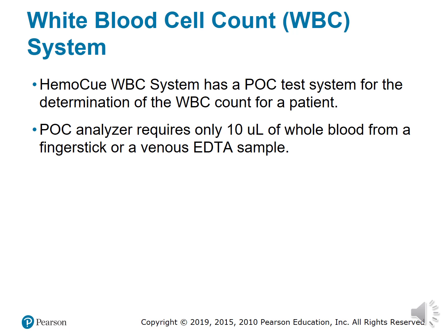Another point of care testing instrument that is now being used is your WBC system. This one also happens to be a HemoCue, but this one is called a HemoCue WBC system, which tests to check your white blood cell count. Because remember, if your white blood cell count is elevated, that means it's fighting some type of infection. Or you might be pregnant. Congratulations for women, that is.